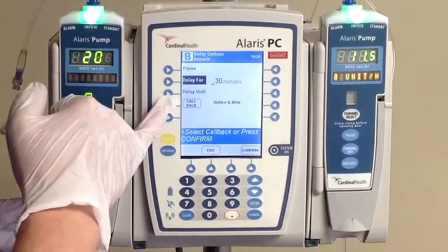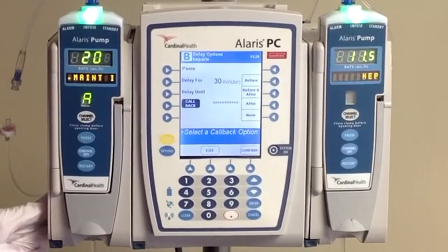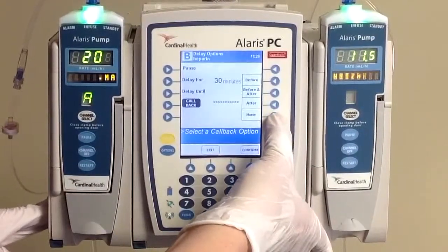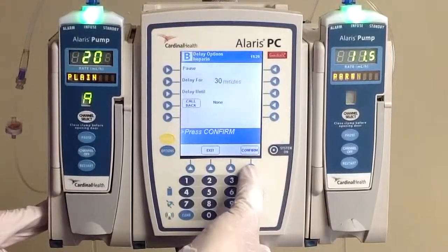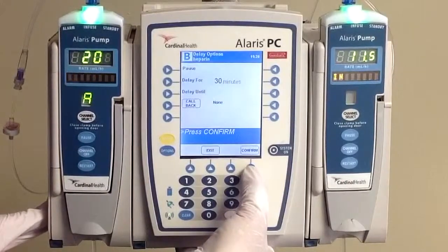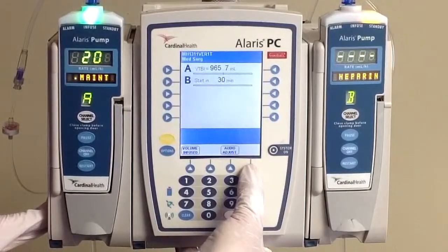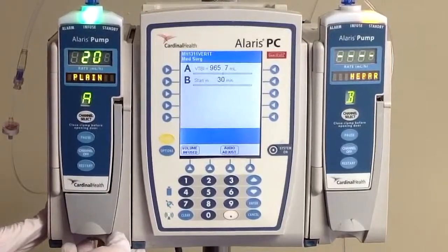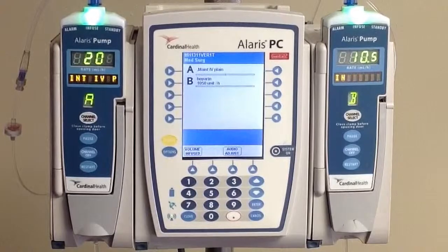Before we leave here, click on your callback options and change this to a no callback option. What that's going to do is after 30 minutes, our pump is just going to restart at our new rate of 10.5. If we use one of the other options, it would stop the pump and require us to come back in. Go ahead and click confirm. You'll notice that your pump is now going to show that it's on hold — on standby with the yellow light in the lighthouse — and it's going to restart in 30 minutes. Forwarding 30 minutes: the delay is done, and we have automatically gone back over to our rate of 10.5.